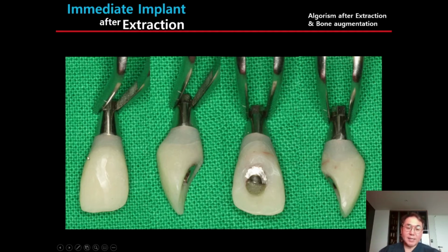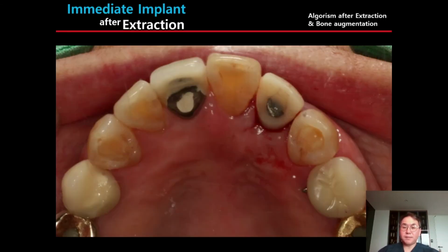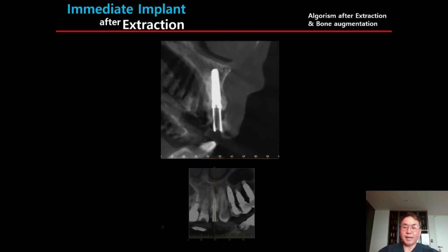After cementing this temporary crown shell to this temporary abutment, this cervical zone should be controlled by the dentist chair side to support the cervical gingiva well. So after cervical contouring with flowable resin, this provisional restoration was connected to the implant, sealing the hole, and occlusal view here, the CBCT.